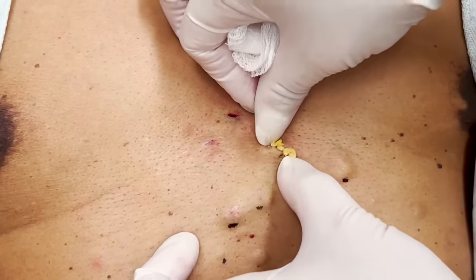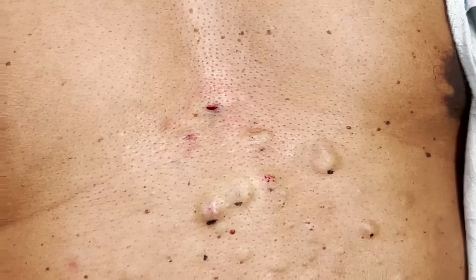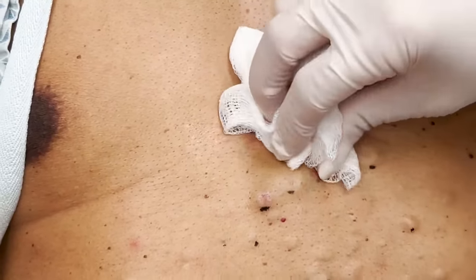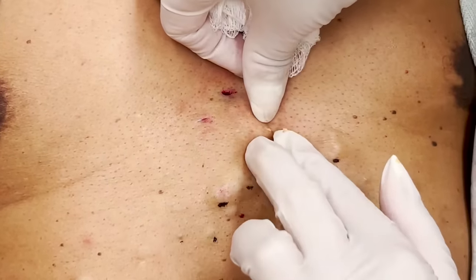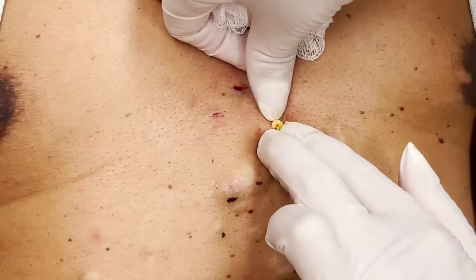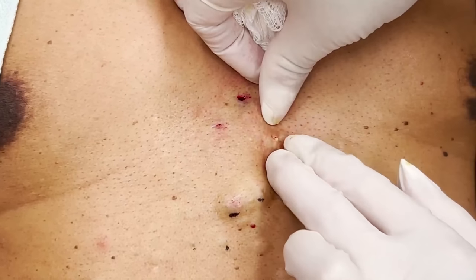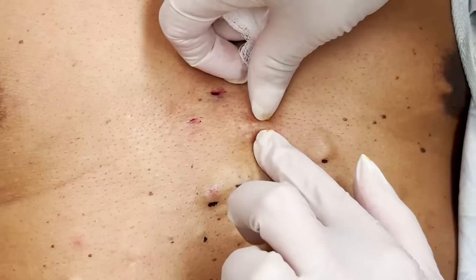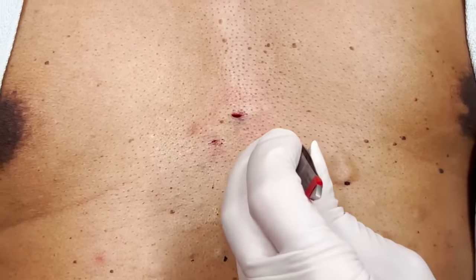I think even so far I've only done three and you've been so well behaved and a lot easier. And also your abdomen is already responding well. You'll see — the first one we did, there was a lot of stuff under there, and it really did make it — you forget how actually concave that area is. And so when you take it off, you're like, wow, look at the beautiful contour of his chest.